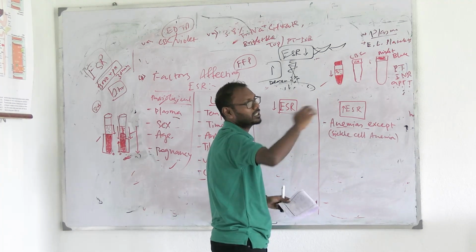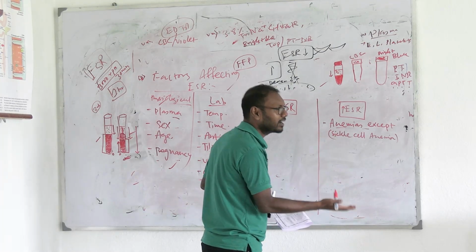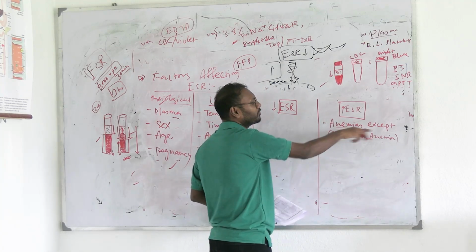ESR is high. So sedimentation rate is high because the time is much shorter and the final result is very much faster. খুব তাড়াতাড়ি সেডিমেন্ট হয়ে যাবে, সেই জন্য ESR বেশি হবে. So this is the pathophysiological condition.